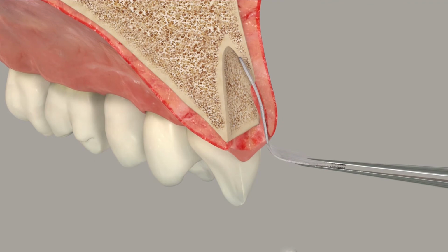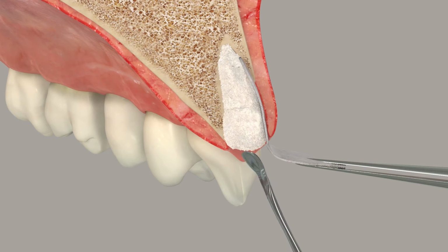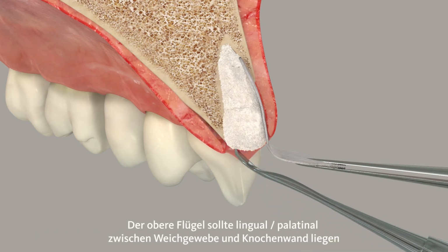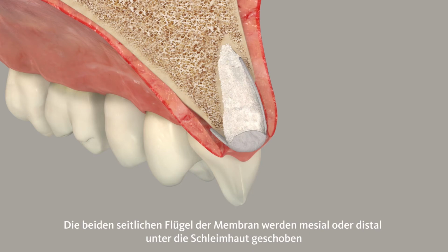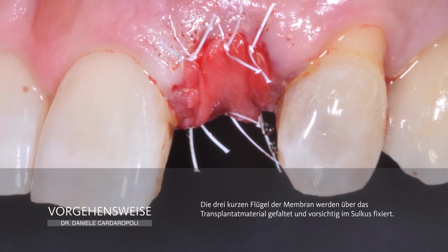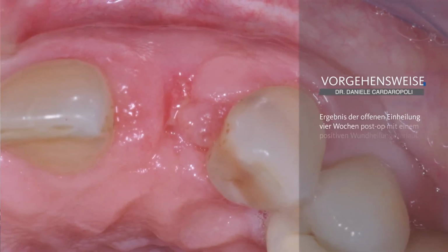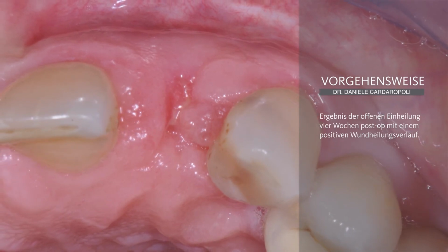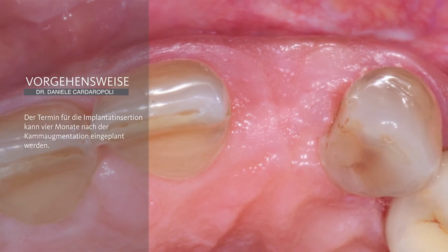As we can see in this image, we have the long wing of the Bio-Guide membrane in contact with the buccal side of the socket. Then the alveolus is grafted with the Bio-Oss Collagen, and then the three remaining wings of the membrane are folded in order to cover the biomaterial, and then the membrane is sutured with single interrupted sutures to the surrounding tissues. With this open healing approach, we have an increase in the width of keratinized tissue, and at the same time, we have a coronalization of the free gingival margin.